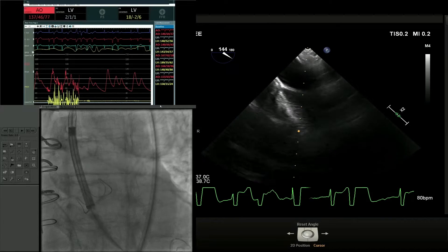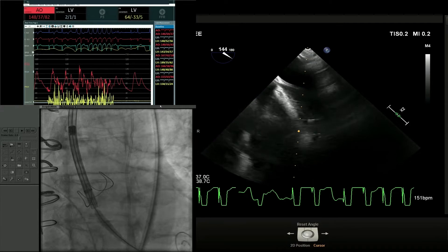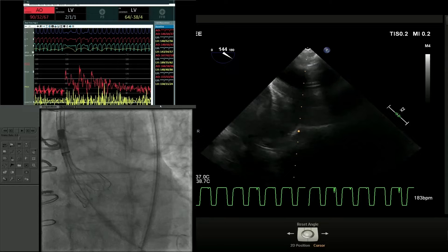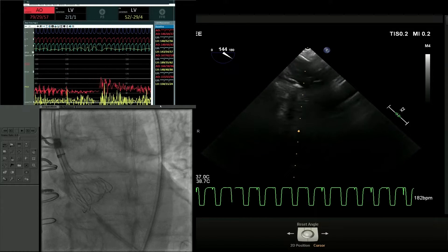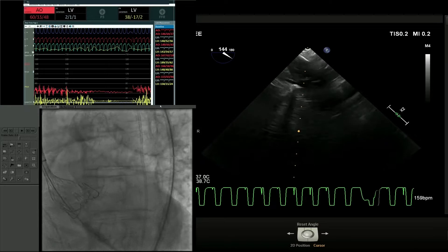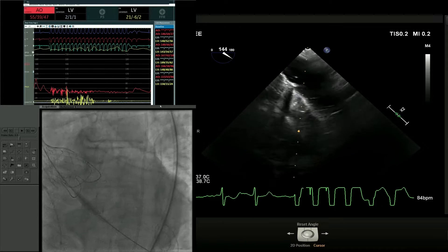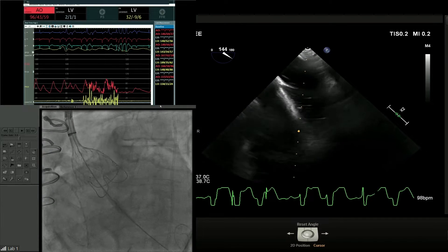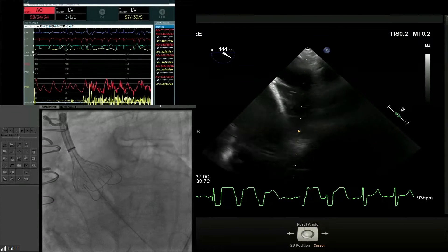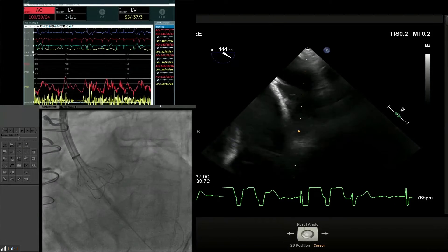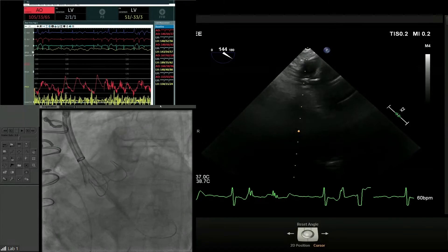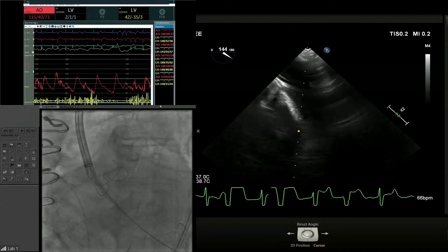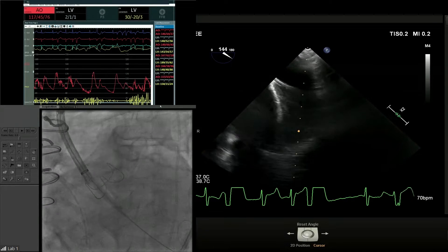Pacing at 150, then 180. Show the hemodynamics. Push — okay, 80. It went up. Look, it popped out even with 180. You had it planted too high — that's why you popped out. It had nothing to do with pacing. You were at zero. Pull it up a little more. And that's a lesson learned from the previous case: very short pacing runs, and not 180.